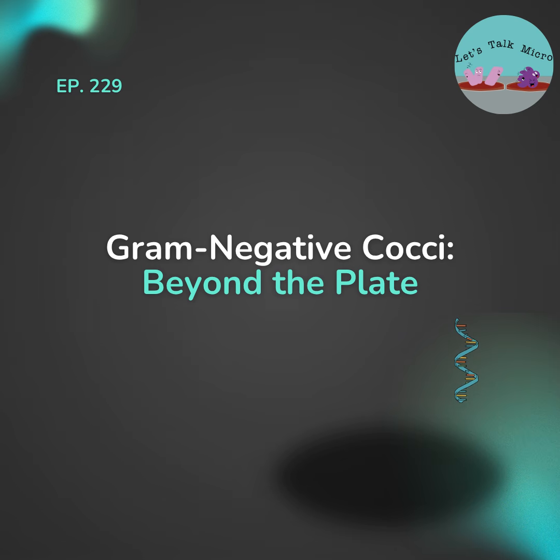Okay, so before we continue, let me talk a little bit about the nucleic acid amplification test, or NAAT. Basically, for the nucleic acid amplification test, you extract the nucleic acid, you amplify a specific target using a method like PCR or transcription-mediated amplification, and then you detect that amplified product with a probe or a fluorescent signal. If that target is present, the signal lights up and the instrument calls it positive. And this happens in a closed system, which is very cool.